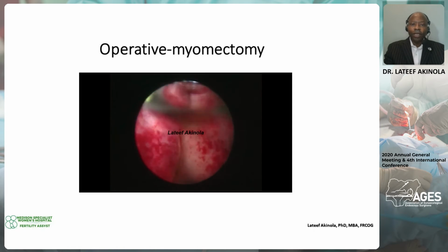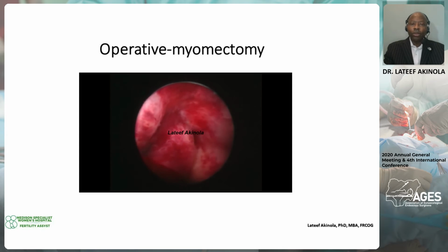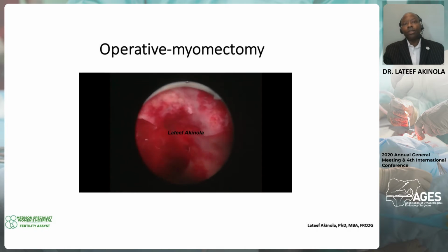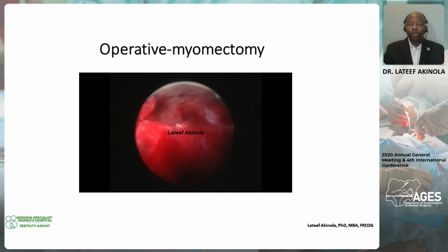As we can see the fibroids here, and as I mentioned earlier, you can use slicing techniques. You can use cold loop to bring out the fibroids. Eventually, you can use suction to do it.